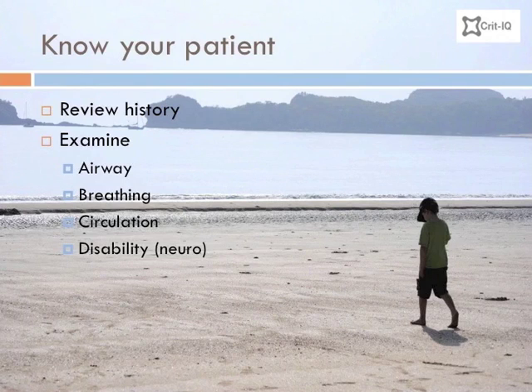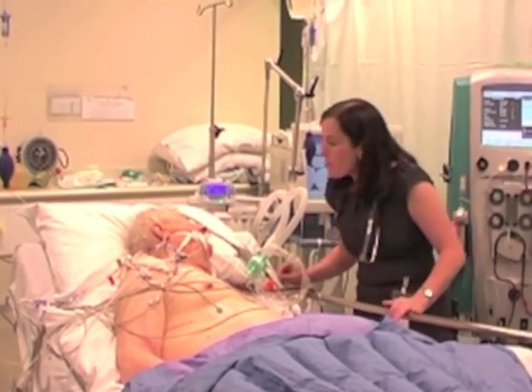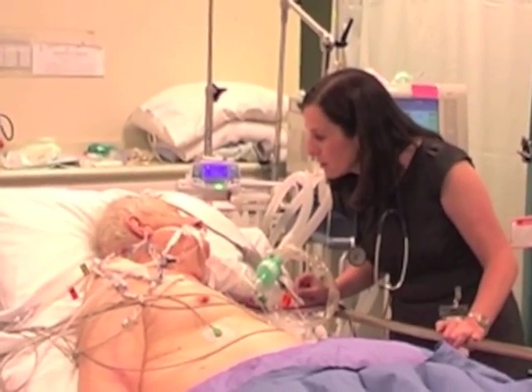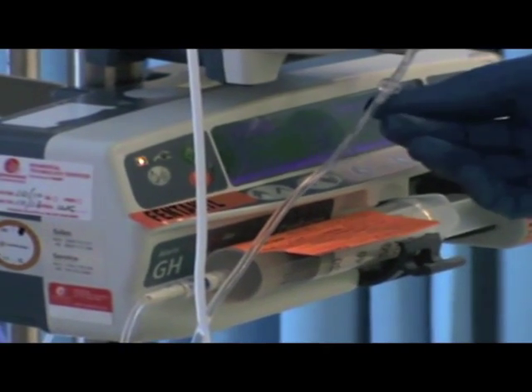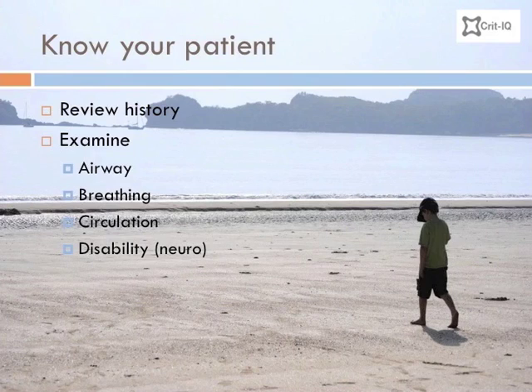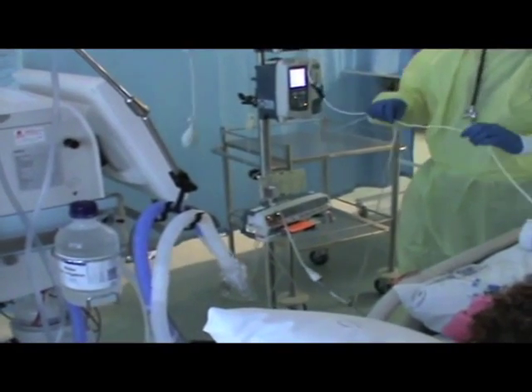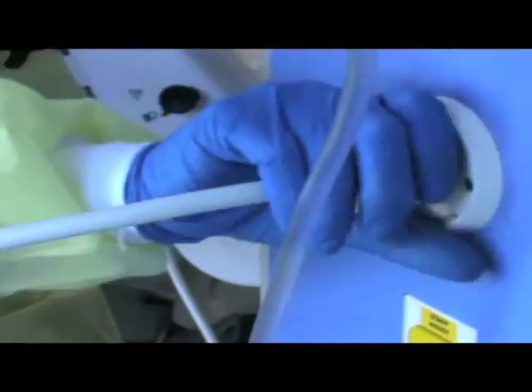Disability. How awake is the patient? Are they agitated or calm? And will this be a problem? What sedation is the patient on? Have they recently had a fit? Environment. Check out the environment around the patient. Consider the tubing, monitoring, and equipment that the patient is attached to.